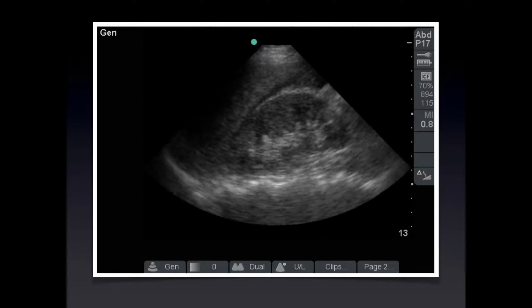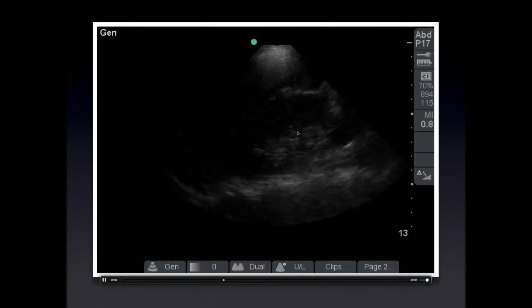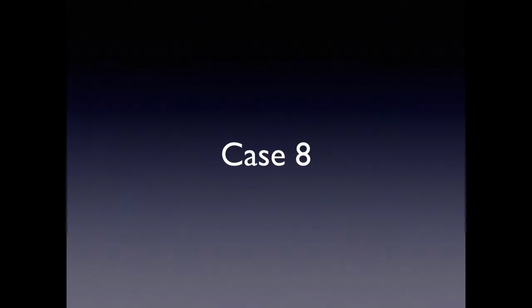This patient also had an associated positive FAST exam. Kidney, liver, stripe of free fluid in Morrison's pouch, which is both diagnostic of ectopic pregnancy as well as a strong marker for the need for operative intervention. Another life saved. On we go. Case 8.